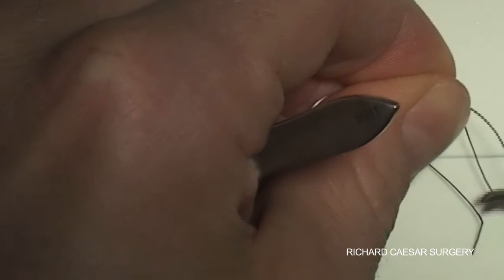This way you get deep closure and nice skin apposition to guarantee a good scar. One or two throws, and another throw anti-clockwise — a reef knot to lock.